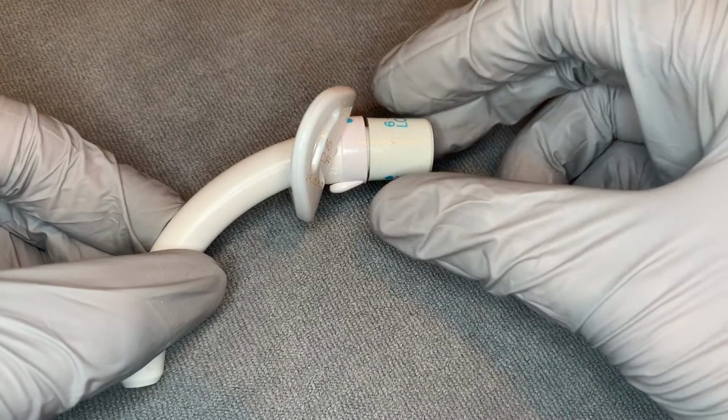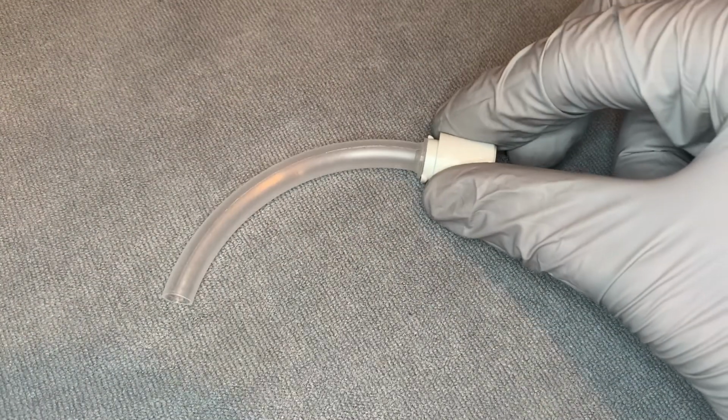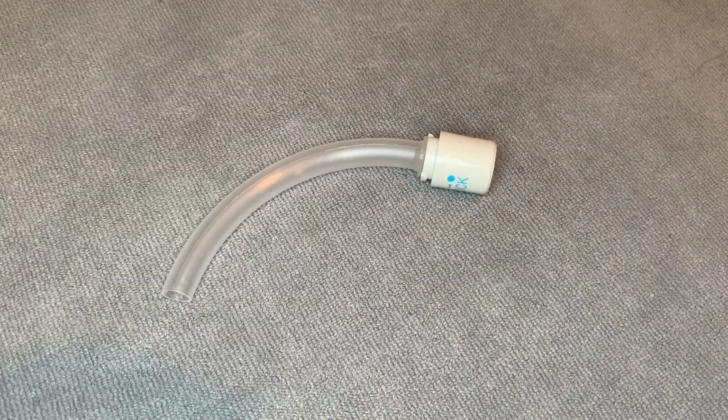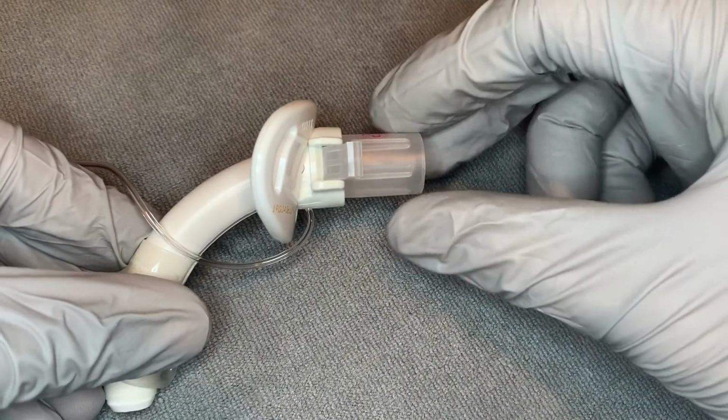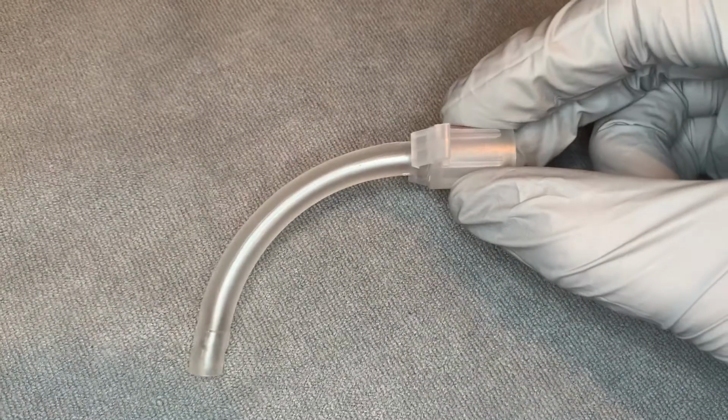Some tracheostomy tubes have an inner tube that can be removed and cleaned and replaced. This tube is called an inner cannula. This allows for cleaning to prevent blockage without removing the whole tube. It either twists on or is snapped into place.